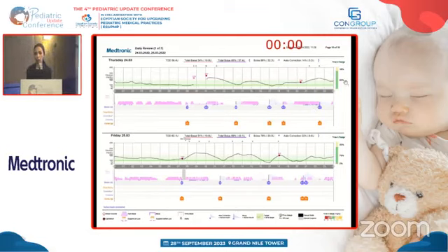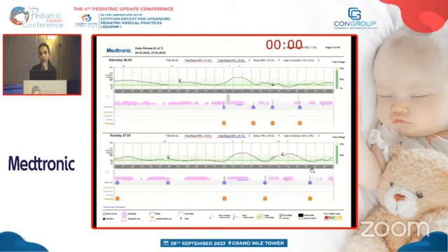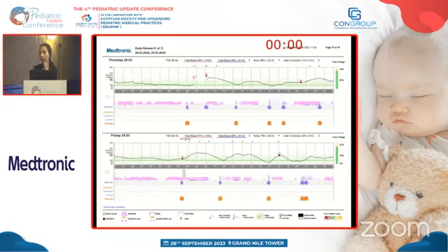اليوم ده كان الكنترول بتاعنا تقريبا 82%، اوتو كوركشن 14%، ده معناها ان السيستم ما عملش ايفورت رهيب عشان يوصلني للكنترول. اليوم اللي بعده تقريبا هلاقي نفس الشكل عندي، ان انا بعد الميلز عندي اوتو كوركشنز. اوكي، ممكن يكون بياخد شاور او حاجه في فصل البومب، هي مده بسيطه.